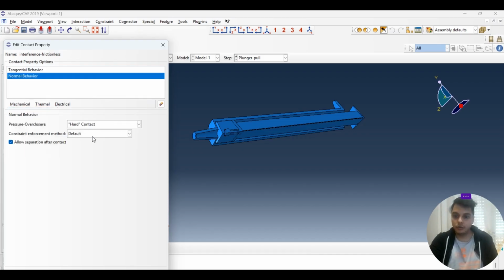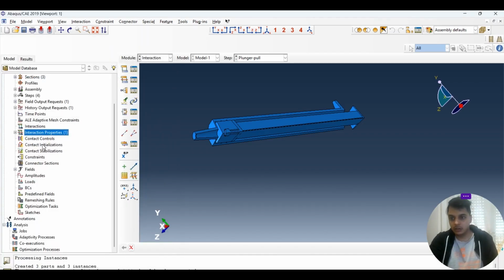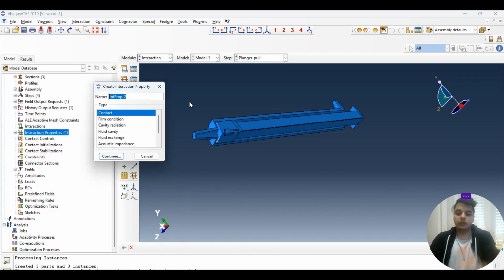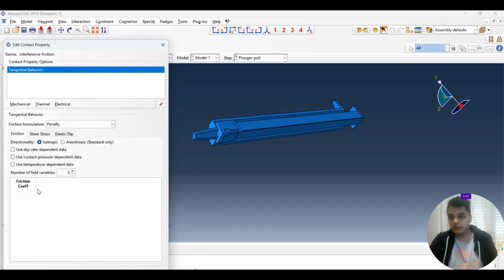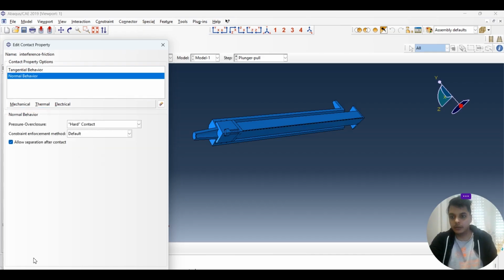And normal behavior, how we want the contact algorithm to work. Let's say hard contact, so that we will get to know the penetration effects, I mean, once the part gets touched. Then again, we have to define another one, that is the interference friction contact. Again, we have to define the tangential behavior, but here we will define the penalty base, and the coefficient of friction is 0.1. And again, the normal behavior hard contact.